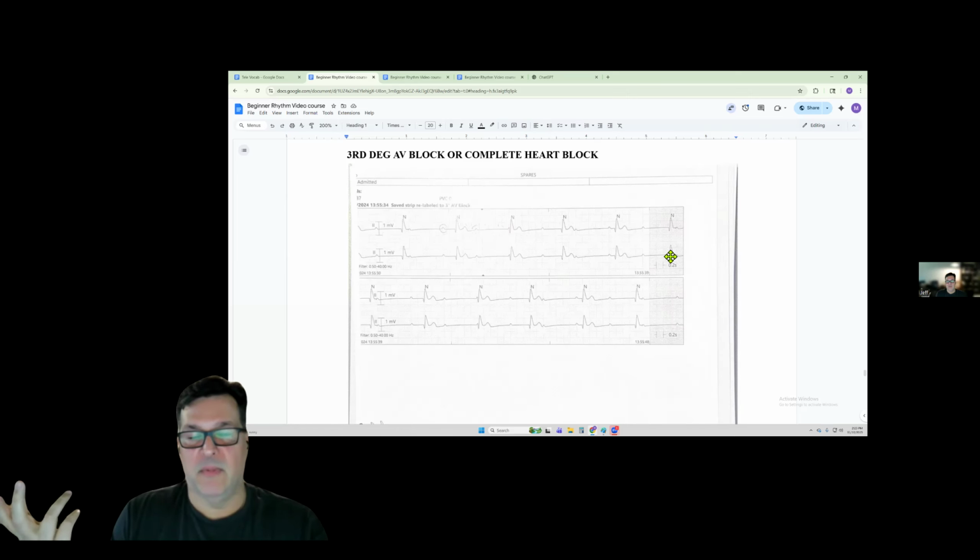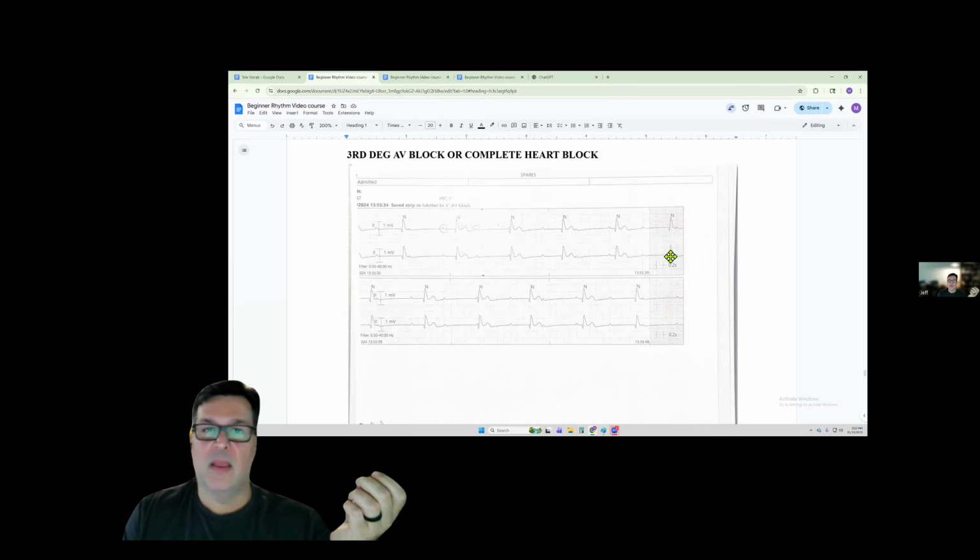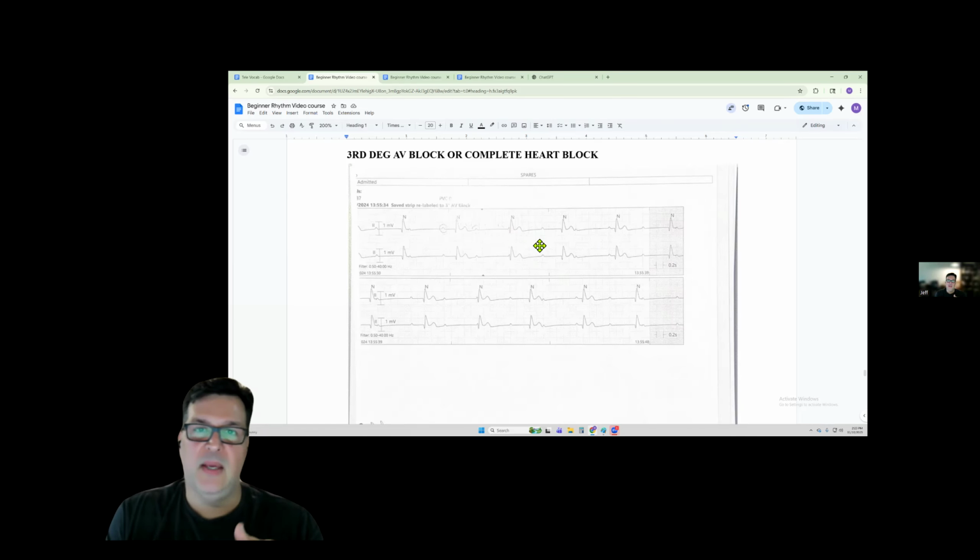Anything that originates from the ventricle is going to be a big wide QRS complex, right? But then that is going to be very regular unto itself. It's not an excited cell. It's an ectopic pacemaker cell coming from the ventricle. So that R to R is going to be very regular. The P to P is going to be very regular, but they're not talking to each other. The P wave is taking care of the atrial chamber. The QRS is taking care of the ventricle chamber.